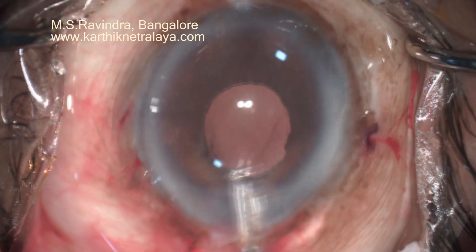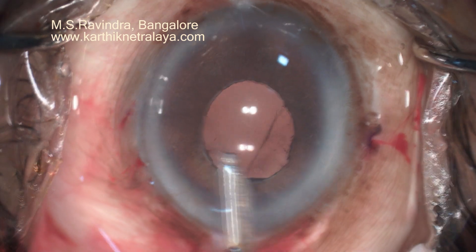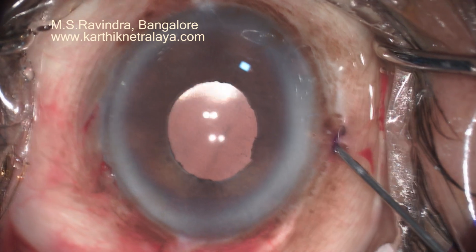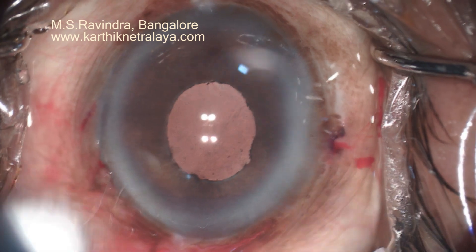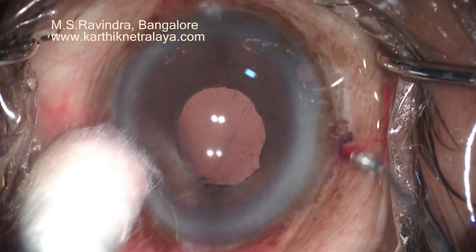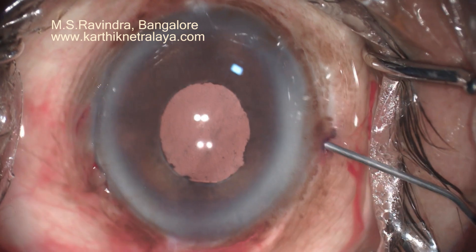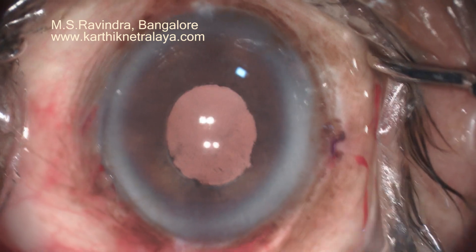The patient had wonderful vision post-operatively. In such complex situations, fixation of the lens well behind the iris is the least invasive procedure — sparing vitrectomy, sparing involvement of the vitreous space, sparing the ciliary body zone and sclera — and the lens remains intraocular throughout. Surgery was done under topical anesthesia with supplementation of 1% lignocaine injected intracamerally.